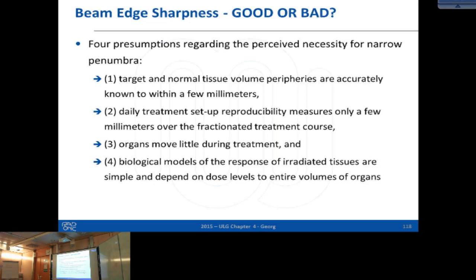But then, if you add those contributions from diagnostic radiology, what the patient has already received during diagnosis, and then if the patient goes to another department for follow-up CT scans, in our radiotherapy community we only see our dose, and then there are some people making not only noise, but fear, just looking at our imaging dose and completely neglecting what's happening with the patient before and afterwards. And I think we need to bring all that together. That's my point. We'll need medical physicists in the radiology department, as I see in mine.